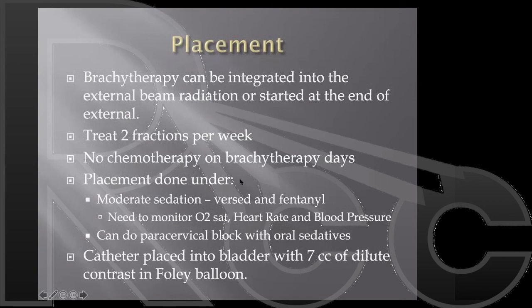The placement is done in our hands using moderate sedation with Versed and fentanyl. The recommendation in the United States is that patients have heart rate and blood pressure monitors, that they're on an EKG monitor, and we monitor their oxygen saturation throughout that procedure. Alternatively, you can do a paracervical block or a pudendal block with oral sedatives. And in some patients, that works fine. But many patients need the anxiolytic qualities of Versed in order to get through the procedure.